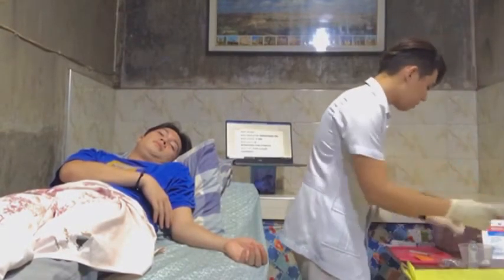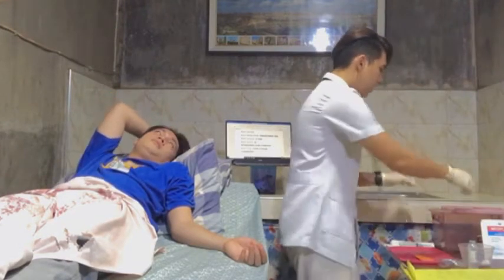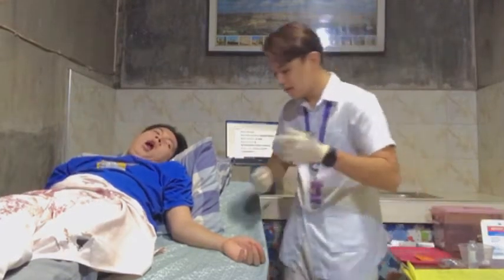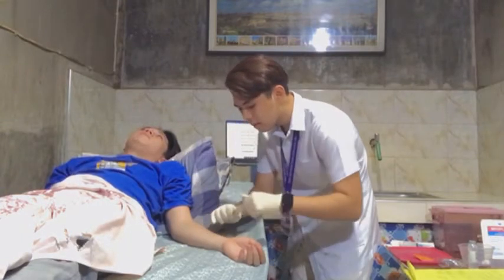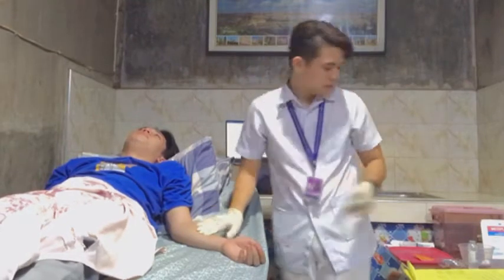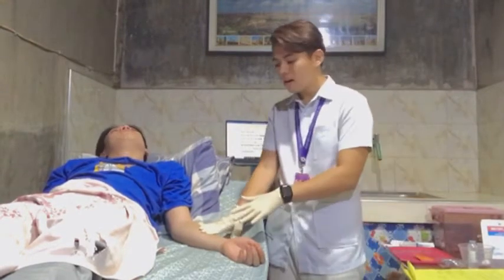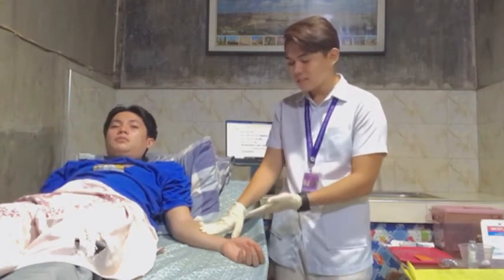Of course, do not forget to make your area clean always. And of course, we need to mark this one. Sir, I would like to advise that you do not touch this one or remove it, okay? Also do not use any red pen because it may influence the reading, and having the patient rub the area may interfere with the test results by spreading the meds to the subcutaneous tissue.